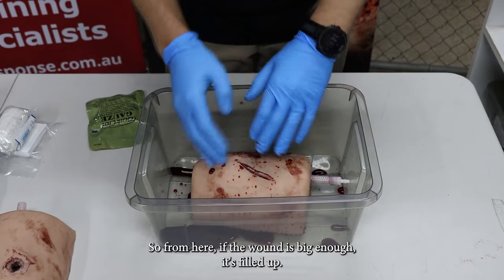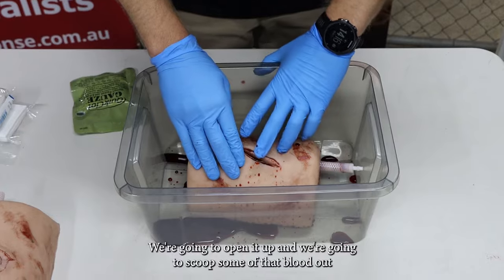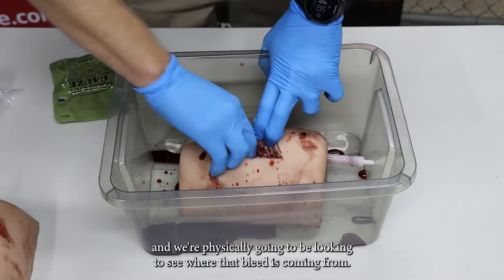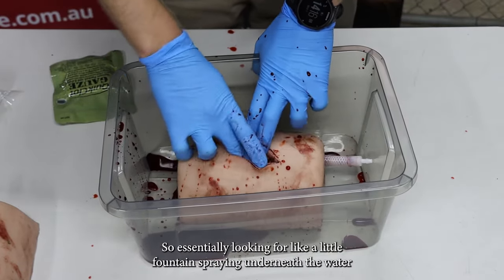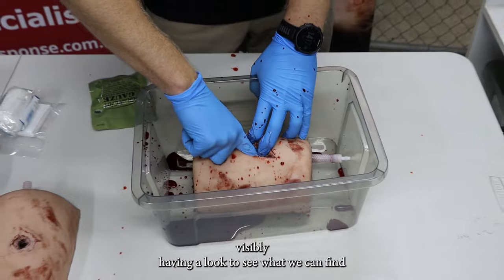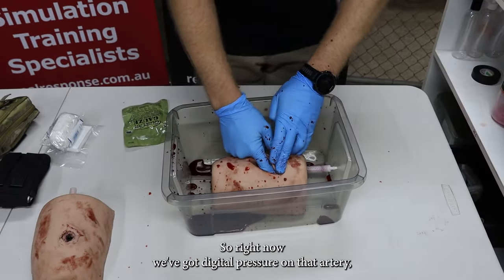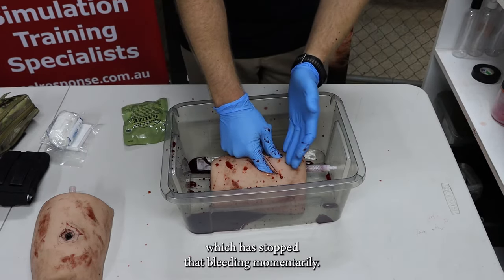If the wound is big enough and it's filled up with blood pooling around the area, we're going to open it up and scoop some of that blood out, physically looking to see where that bleed is coming from — essentially looking for a little fountain spraying underneath, visibly having a look at what we can find and then putting our finger directly on top of that.